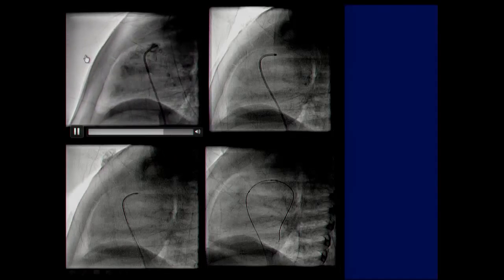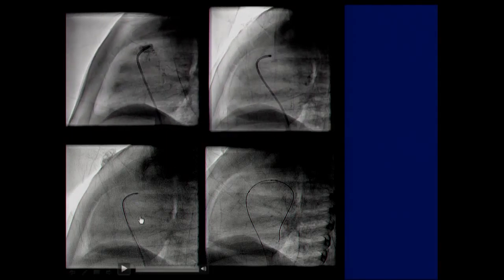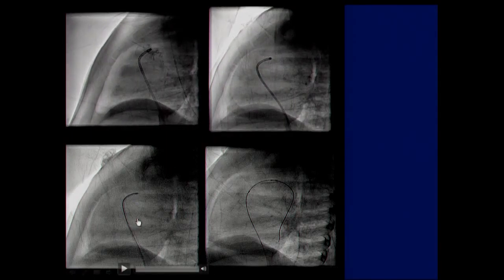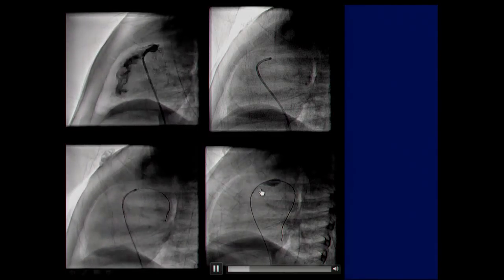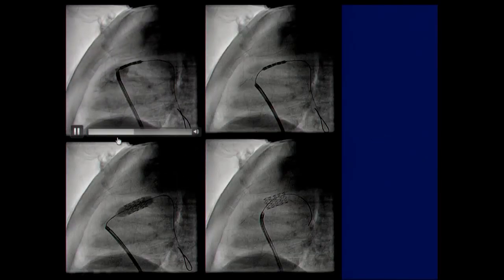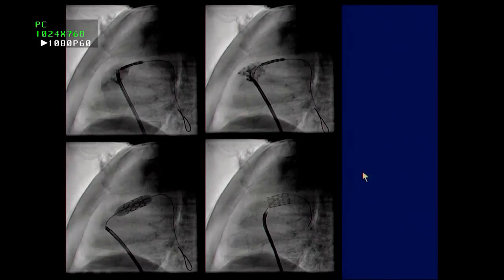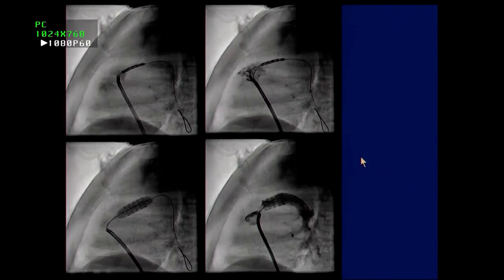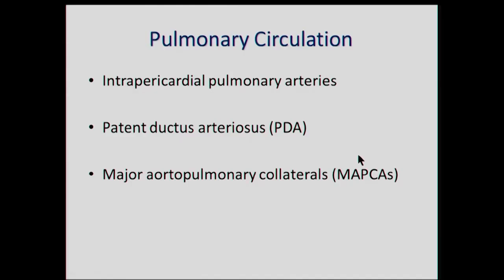And this is an example of isolated valve atresia with tetralogy of Fallot, which was palliated in the cath lab. And you can see this angiogram, and you can see that the valve is perforated using a guide wire, which is used for crossing chronic total occlusion. And then you dilate the valve with a balloon. And then subsequently, you can take a stent in the right ventricular outflow tract, and then you can stent the right ventricular outflow tract, as has been done here. So this patient subsequently underwent total intracardiac repair with a transannular patch and removal of the stent.